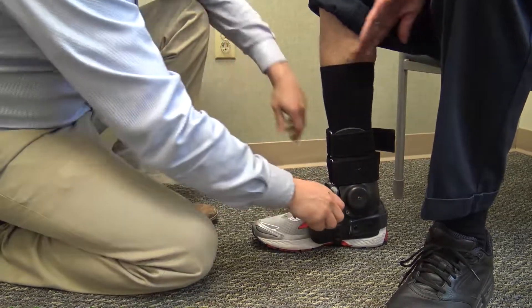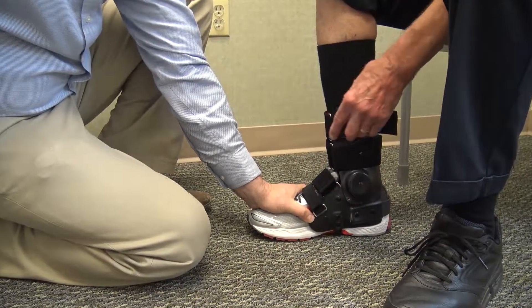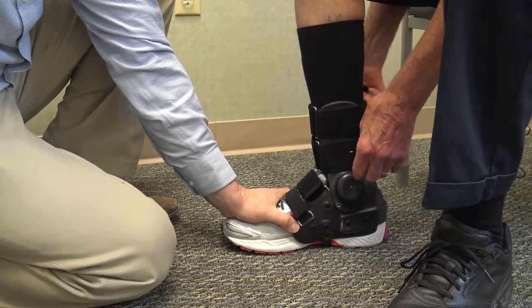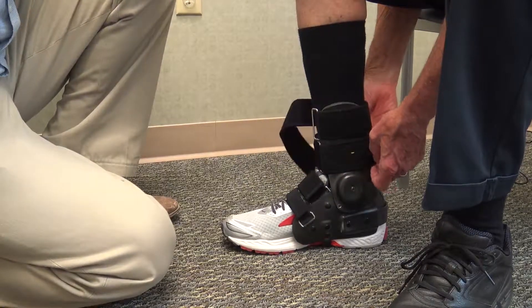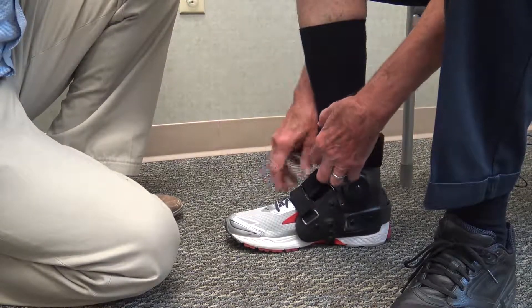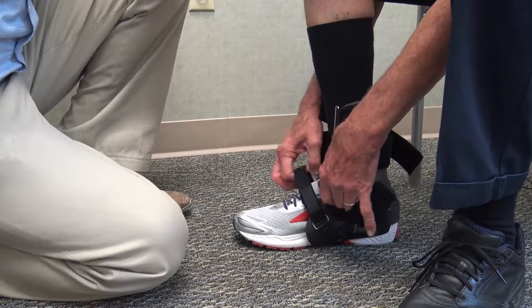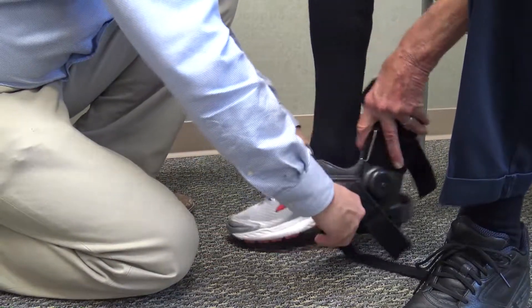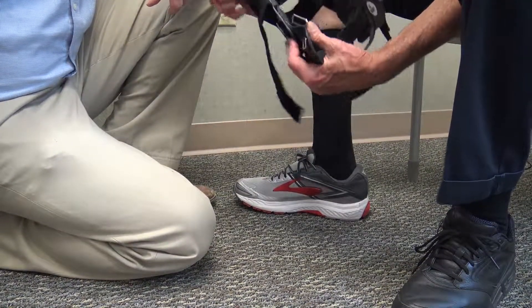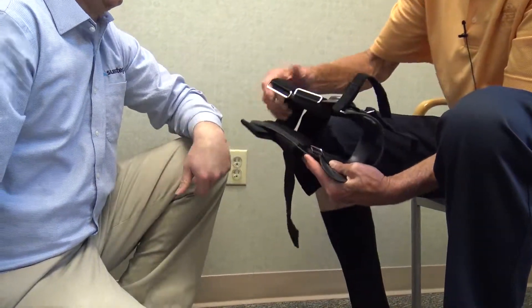Now, before you take these off and start over, you take the whole thing off, and you may have to bend it — like if this feels a little snug here. In order for code L1971, it has to be custom fitted, so you have to modify it in some way. You may have to bend these side struts out, just over the side of a table, or if you're strong, you can use your hand and bend it — both sides.